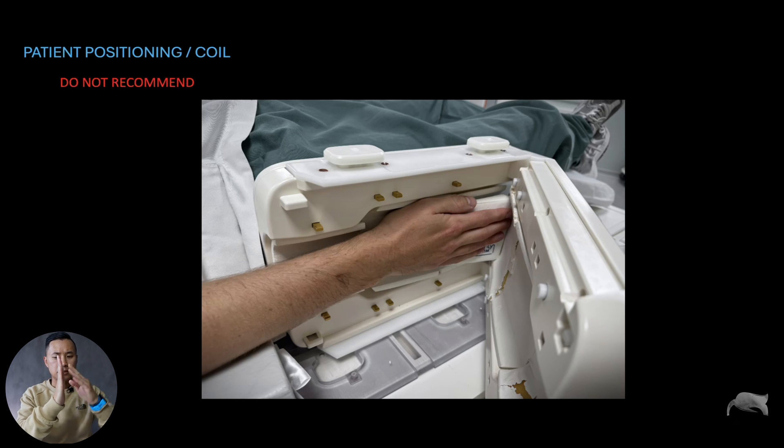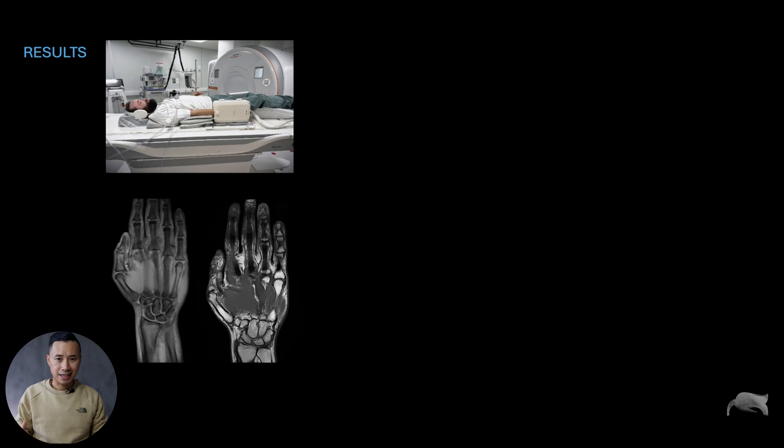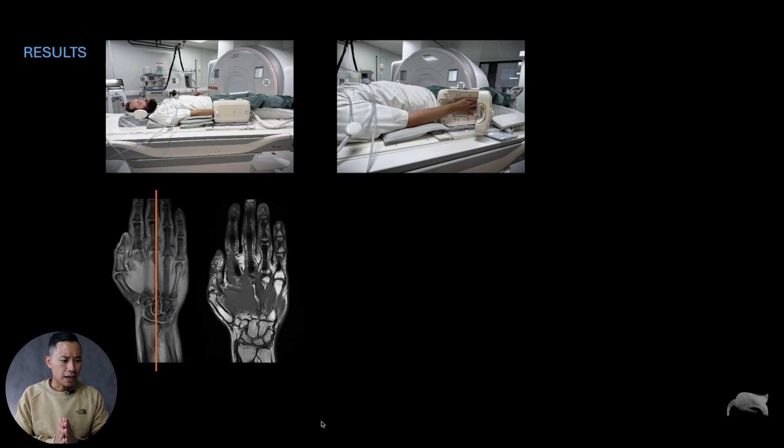Let me show you some images. This is the first one — the recommended positioning: most comfortable, straight line, fingers all together and fixated. You get images like this. This is a coronal localizer with a larger field of view so it's easy to see the radius and ulna. We get a nice straight line from the fingers through the wrist and into the forearm.